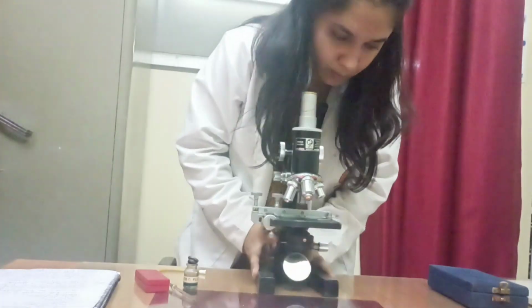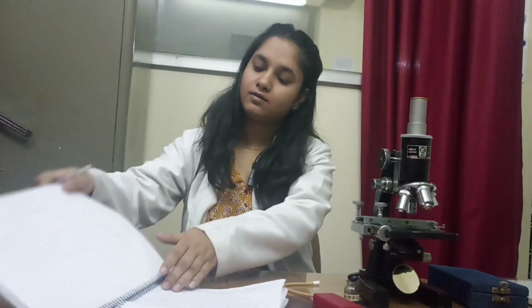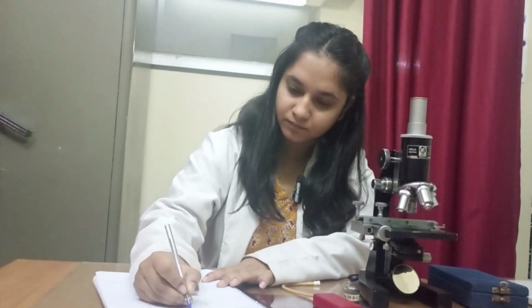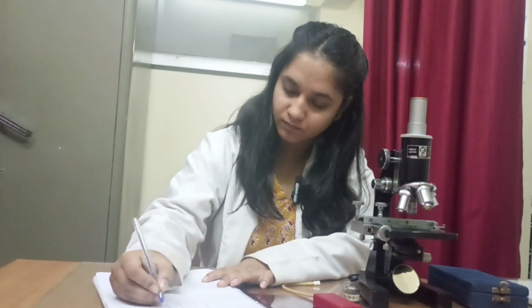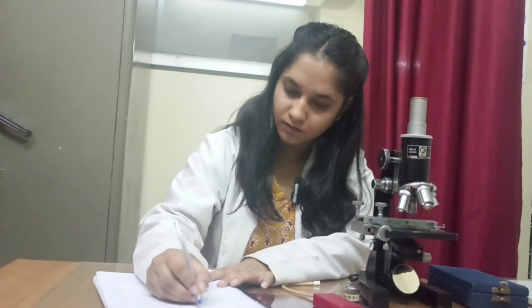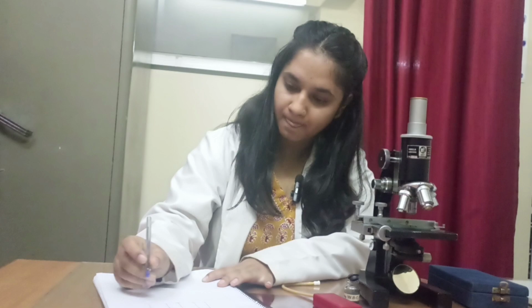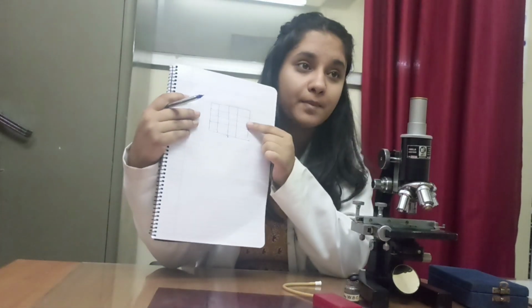After focusing on this Neubauer's chamber, we should get this type of image. This type of image we get in the microscope.